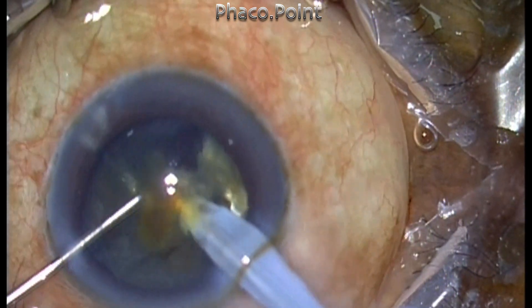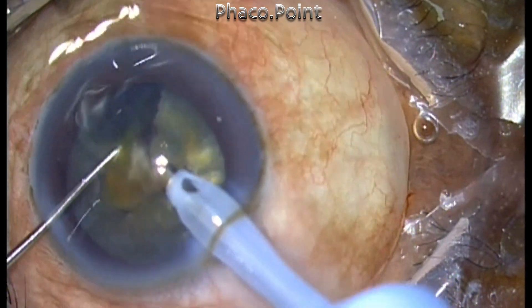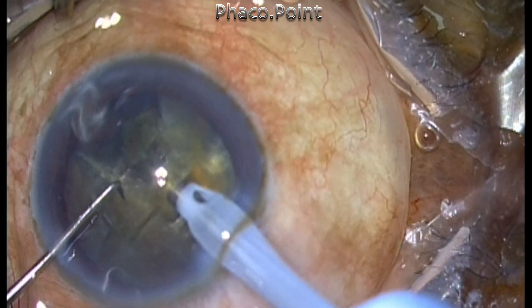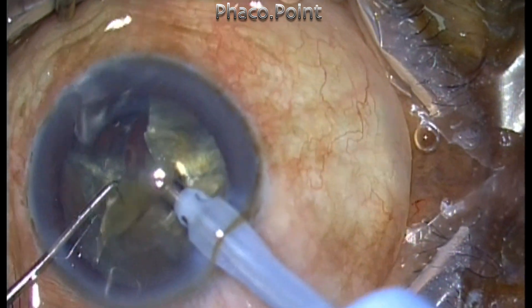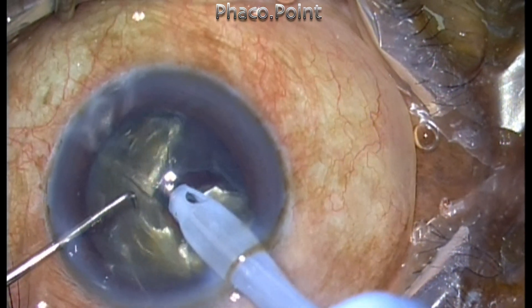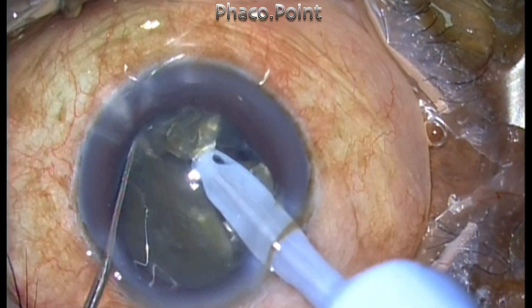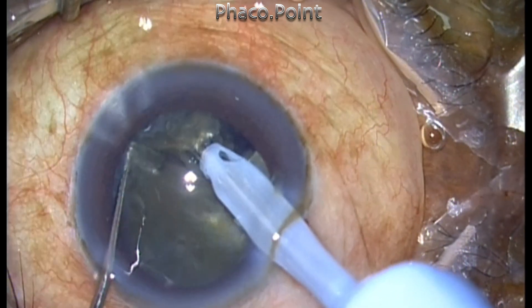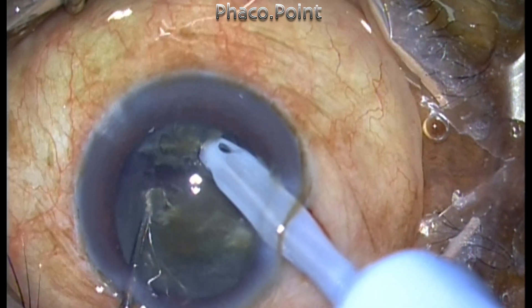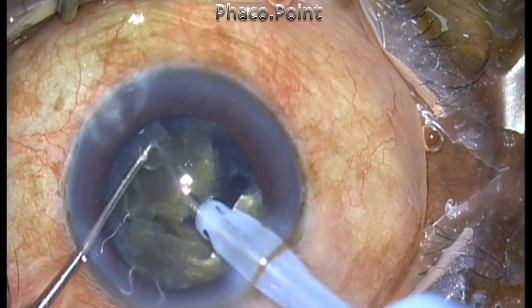This is the first fragment that I am removing. The moral of this story is to create small fragments. Normally we create four fragments — whether it is divide and conquer or stop and chop — and that is okay in a grade 2 nucleosclerotic cataract. But remember: the harder the cataract grade, the smaller should be the fragments, because the nuclear substance is much larger. Even if you create small fragments, the total mass will equal that of four fragments in a grade 2 cataract.